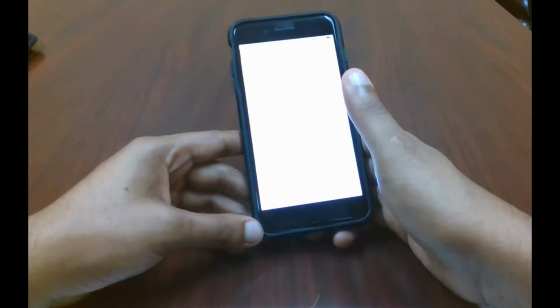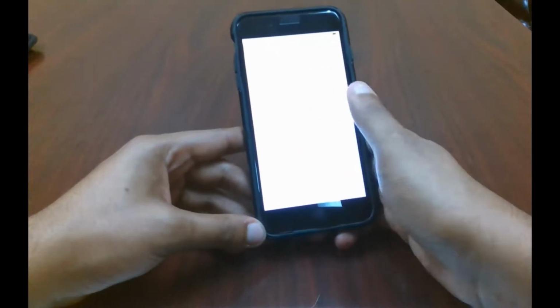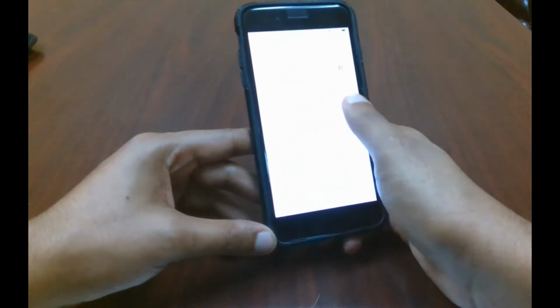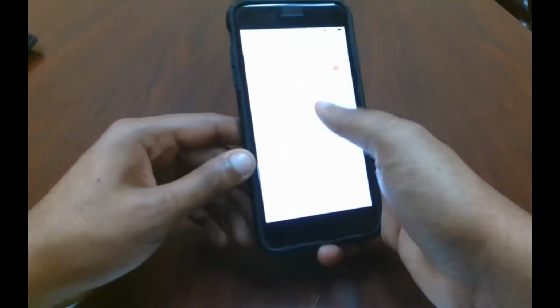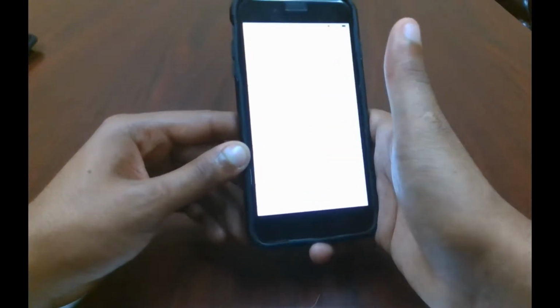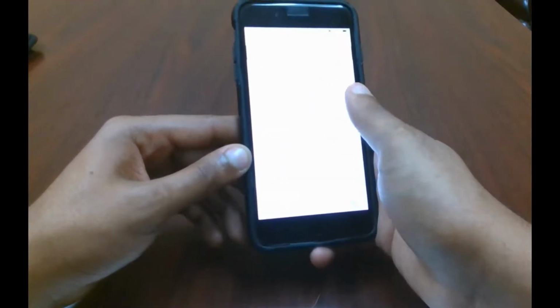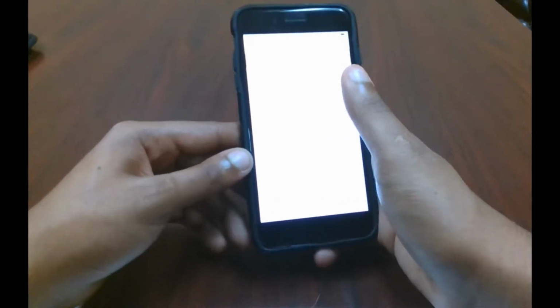And as a quick side note, we will be coming out with VoiceOver videos at some point in the future. So as you heard, there is a section on here called accessibility. So if you start with about, you're going to just keep swiping until you hear it say accessibility. Then you're going to double tap again. Then you hear the heading accessibility. And then the first heading you hear under that is vision. Now that means you're in the right place.